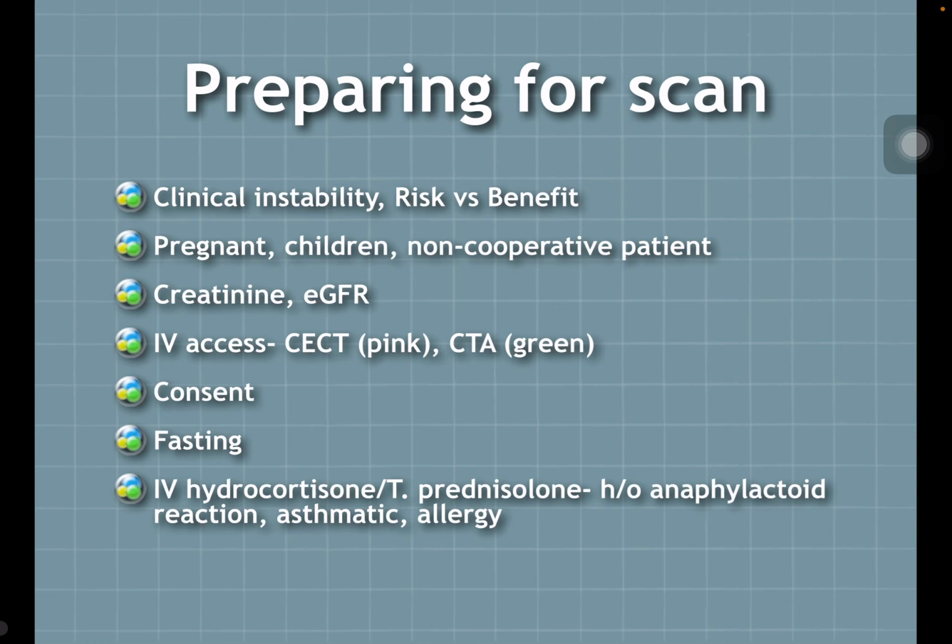So in case of a patient requiring sedation, for example, a non-cooperative patient or children, sedation might be helpful to facilitate the imaging. So if the patient is wearing jewelry or piercings, he or she needs to remove them, and it's better for the patient to change into a patient gown. Patient needs to be able to lie flat and be cooperative, and as an additional point, the patient needs to be able to hold breath at least 10 seconds in case of CT thorax.